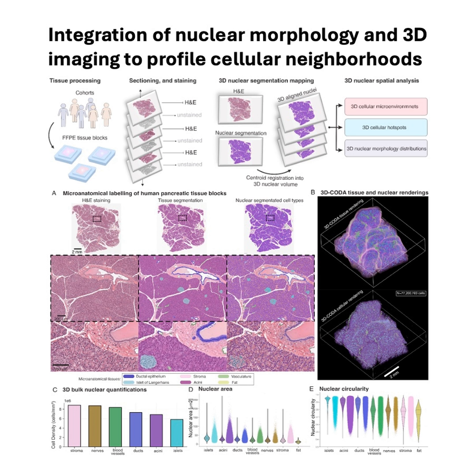But as you expanded the sphere outwards, the relative proportion of those sparser components would decline, while the more abundant tissues, like acini, would start to dominate the volume. So you get this dynamic view of the cellular neighborhood at different scales for every cell. Yes. It allows for a much more sophisticated understanding of the context in which each cell exists and potentially interacts.